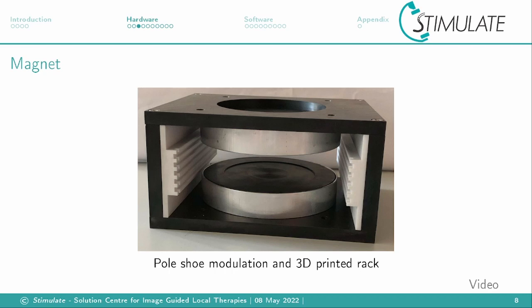Here you can see our small magnet, which consists of two permanent neodymium magnet discs at top and bottom. Around is the iron yoke. Inside are iron pole shoes. The groove you see on the iron pole shoe is called pole shoe modulation and was simulated with different diameters and depth to achieve the highest field homogeneity. We simulated a field inhomogeneity of 11 parts per million, and after assembling we reach about 80 parts per million.